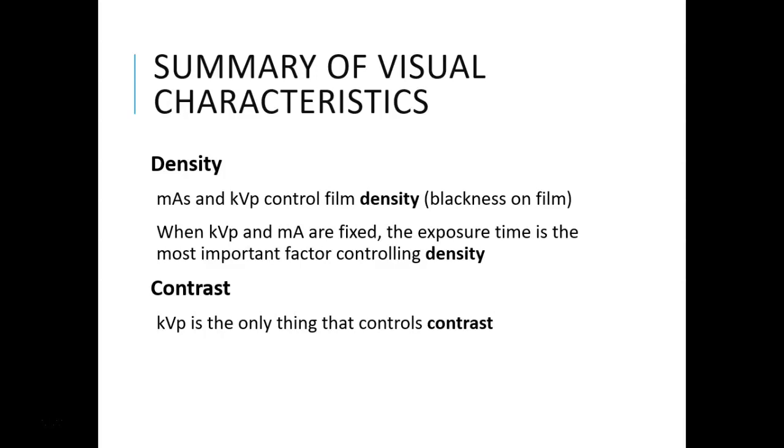So if we pushed the molar button when we're doing a maxillary or a mandibular anterior PA, and we had it on the molar setting, then it would be darker. The film would turn out darker because we don't need that much exposure time when we're doing the mandibular or maxillary anterior. Contrast is only affected by kVp. It's the only thing that controls contrast is kVp.